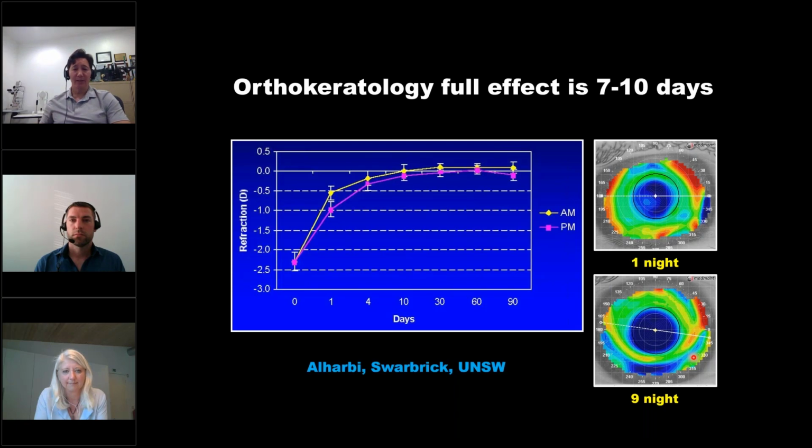So I think this study is one that any new orthokeratologist really needs to appreciate, because it pushes you to wait out your effect. If you're not sure about what's going on, waiting out full effect really makes things much clearer. Is it an ideal outcome, or is it something that we need to modify? Did the effect not come out the way we desired it to?